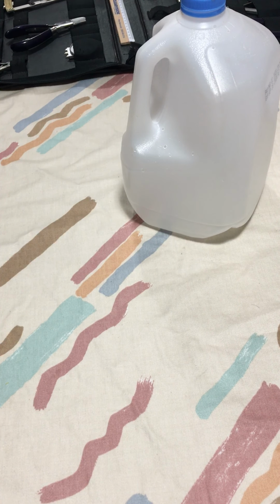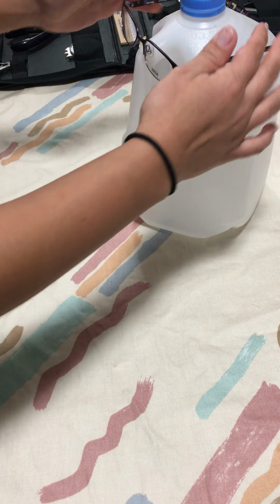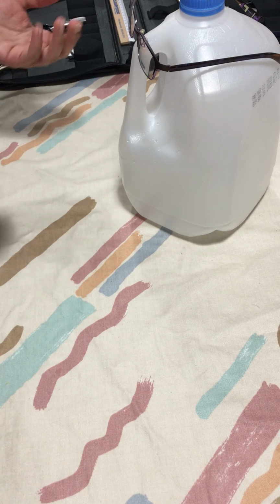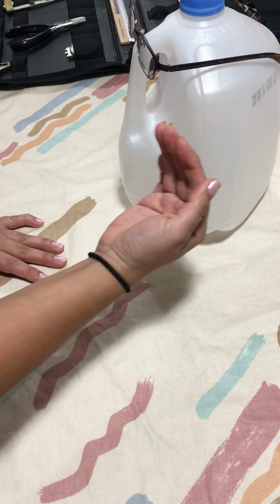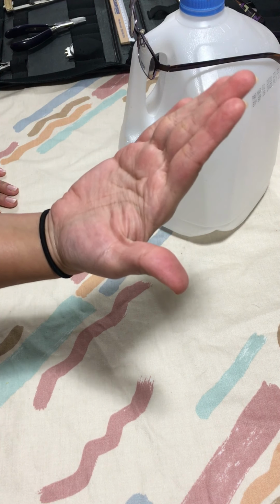Okay. The next one would be this misalignment. It is retroscopic tilt. So if the patient comes in, okay, and the frame looks like this, I could already tell that it has retroscopic tilt. We're not even supposed to be having retroscopic tilt. This just means that the lens is further away from the cheeks and it's closer to the eyes or the eyebrows of the patient. So it's this type of angle, okay?